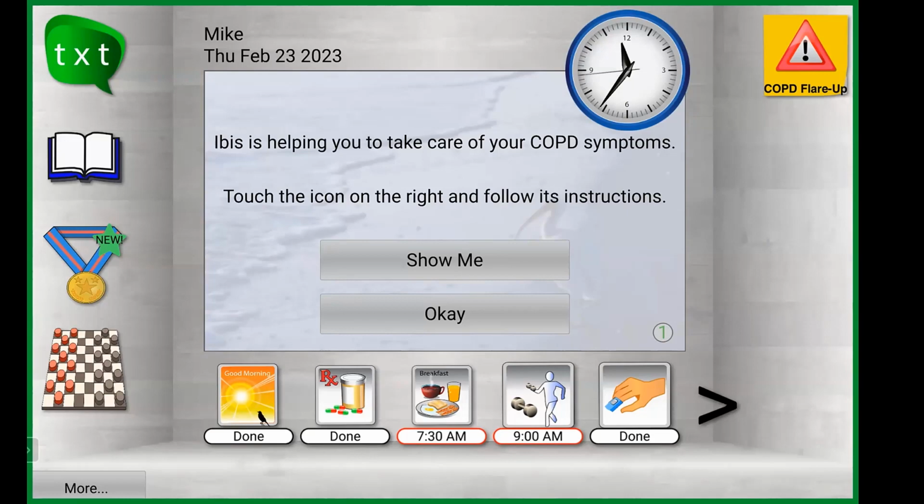just like you would have done if you took that low oxygen and you tried to call the doctor's office, speak with a nurse, ask you to walk through a few steps, maybe use an inhaler or a nebulizer, which is a really strong lung treatment. And we walk you through exactly what the best course of action is to remedy this lower oxygen value. We check in with you very frequently to make sure that it's working and that our recommended solution is making a positive effect. And if not, well then, unfortunately, at least we know that this might be a more serious situation than what we can handle at home.